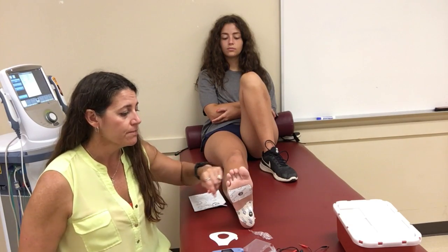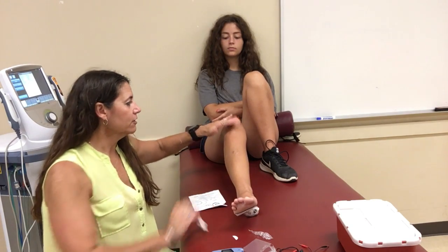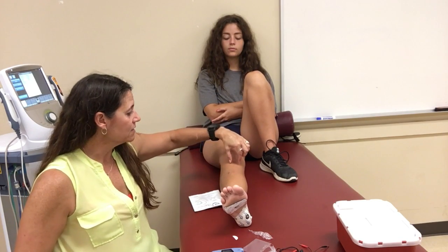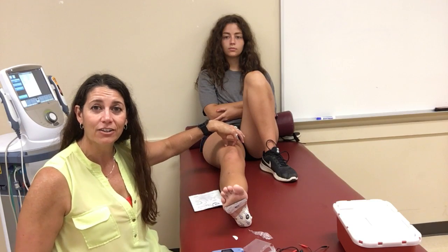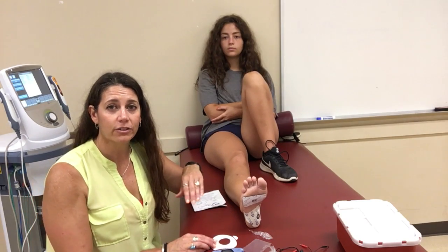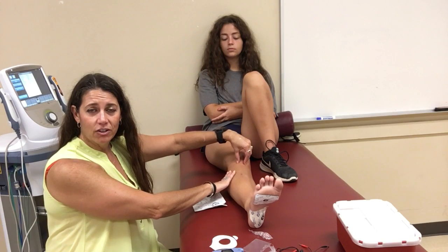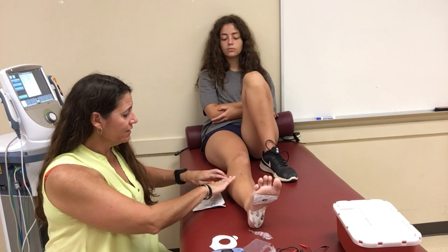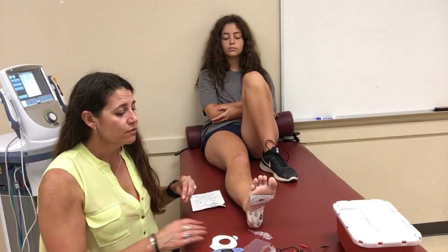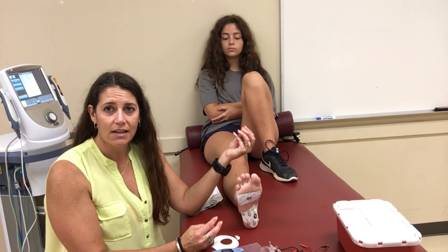For a patellar tendon treatment, you'd place the active pad below the knee and the ground pad above it, so the medicine is pulled through the entire infra- and supra-patellar tendon. If you put the active pad in front and the ground pad on the calf, you're pulling medicine through the anterior lateral compartment — that's not what you want. Think about which tissues are affected and what placement will most effectively draw the drug through them.